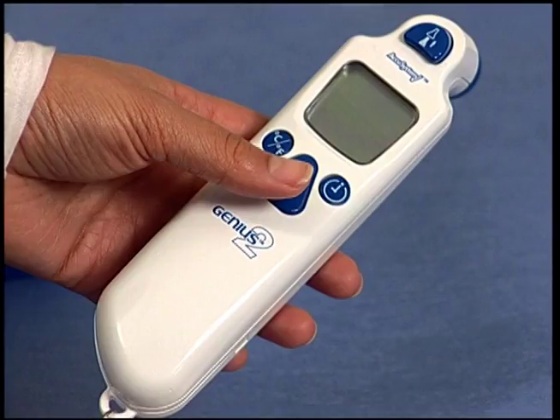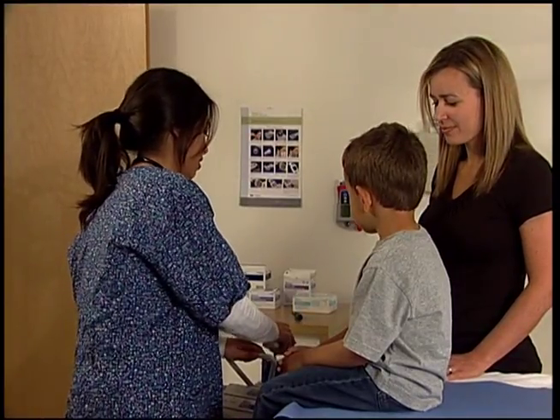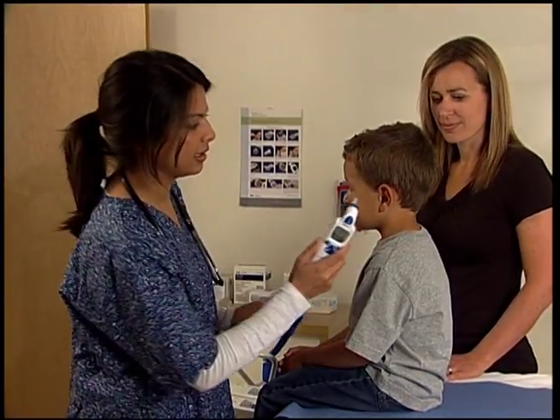The LCD screen will enter sleep mode after 10 seconds of inactivity. To recall the last temperature taken, press and release the scan button. Please note that loading a new probe cover will erase the last temperature taken from memory.